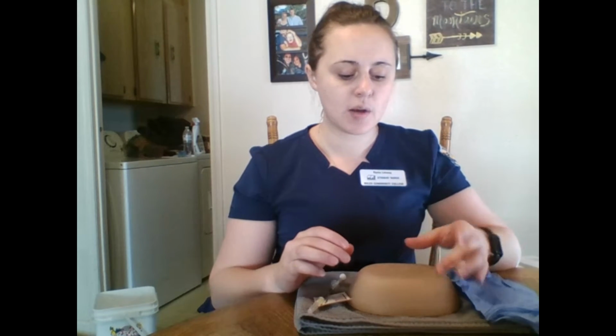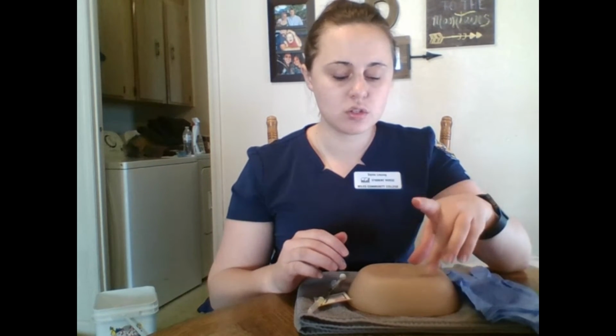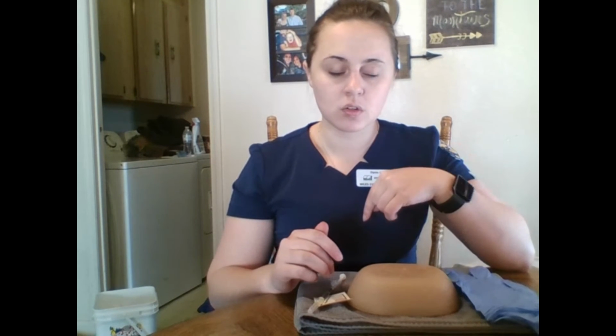Knock, knock, knock. Hello, Skip Rocker. I want to verify his name and date of birth. I want to, of course, pick the right site. And for heparin, it's best to put it in the abdomen. So I would put it in his abdomen, and I'd want to pick a spot 2 inches from his umbilicus, or his belly button. And if one side is more bruised than the other, I would want to pick the less bruised side.